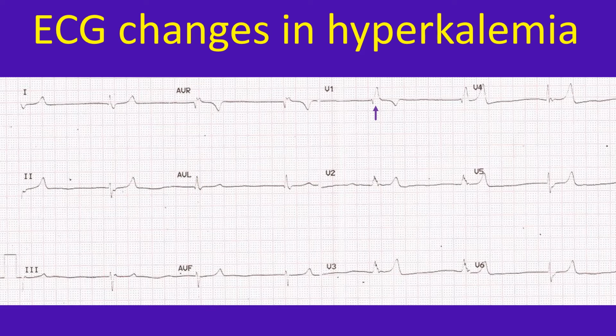3. Lack of atrial electrical activity. No P waves are visible and there is bradycardia. It could very well be a slow junctional rhythm. Ideally, if there was sinus arrhythmia visible in the QRS complex intervals, one could have presumed that there is sinus node activity with atrial paralysis and sinoventricular conduction.